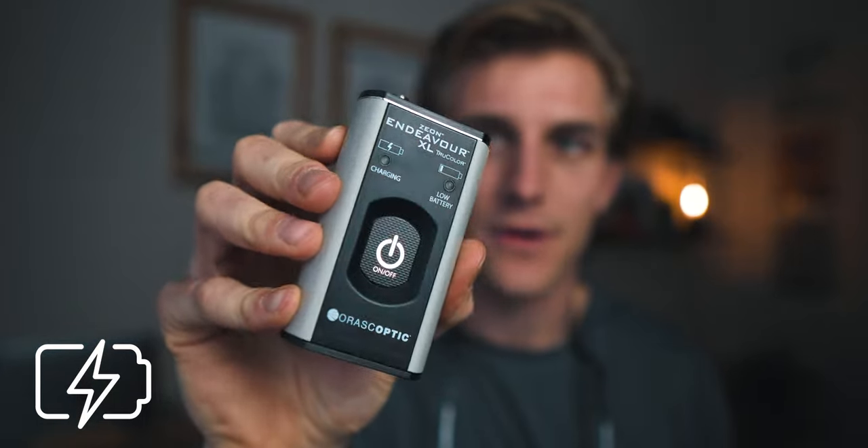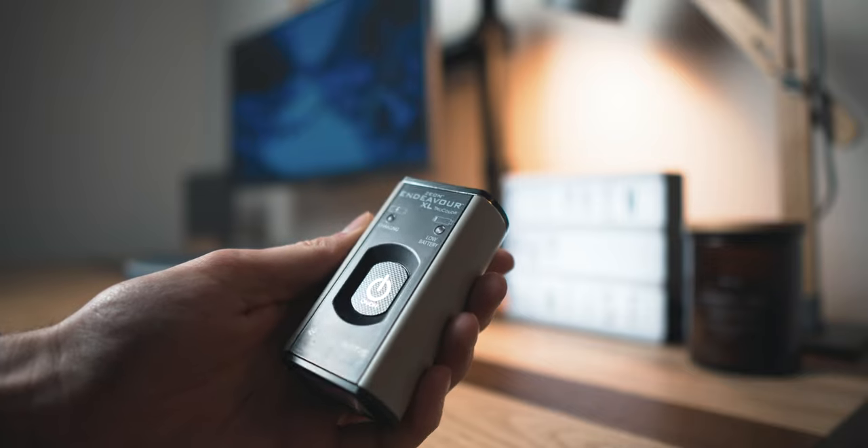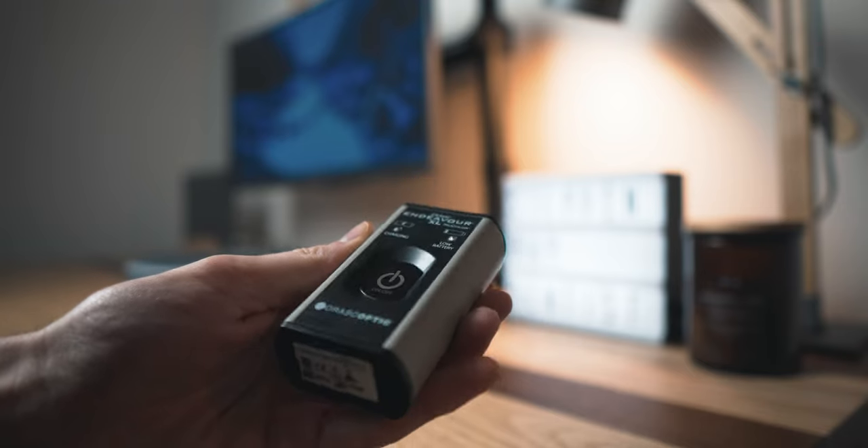This here is the battery from Orascoptic — it's the XL, which is the larger version. I went with this because sometimes I forget to charge things and this one has about 24 hours of battery life, which is pretty insane. If you're a practicing dentist with your own office space you could probably get away with a smaller battery, but for a dental student who's always taking them back and forth, it may be a little bit better to have a larger battery.